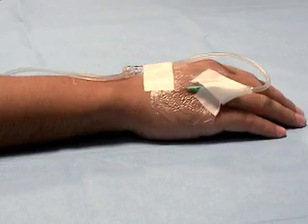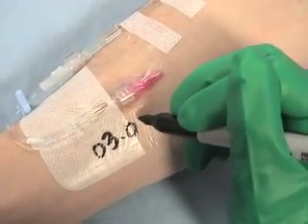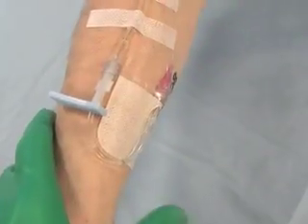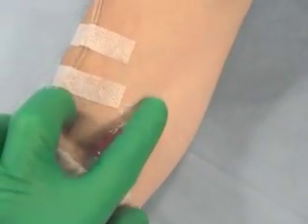or irritation. It is recommended that you write the date of insertion on the dressing to facilitate determining how long the cannula has been in place. To reduce the risk of infection, continue to review the indications for peripheral intravenous catheterization and remove the cannula as soon as possible.